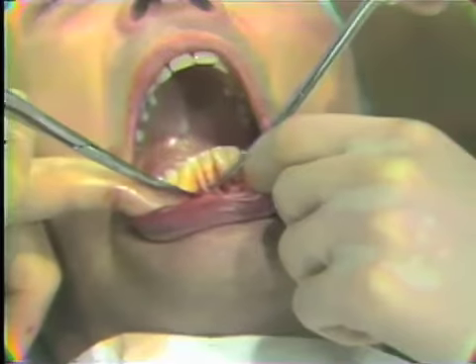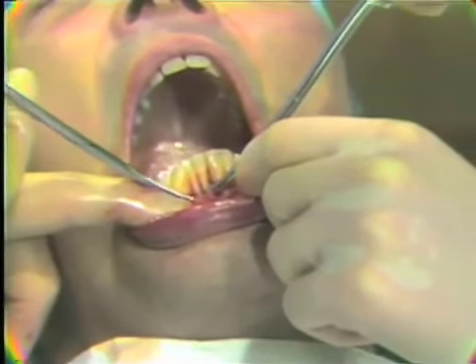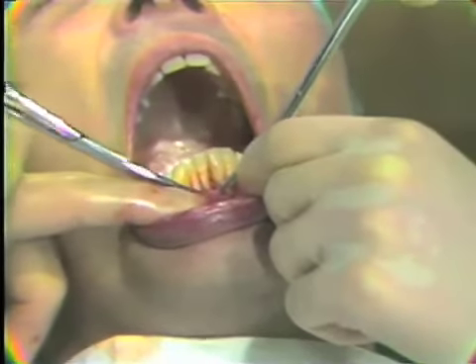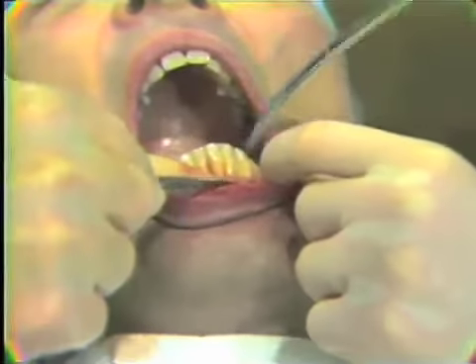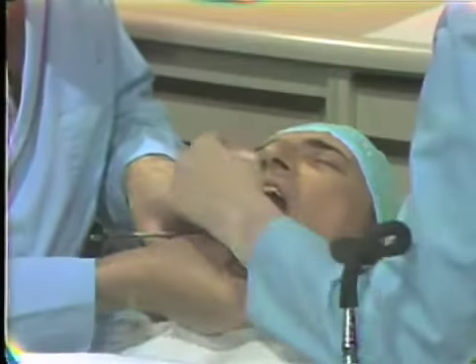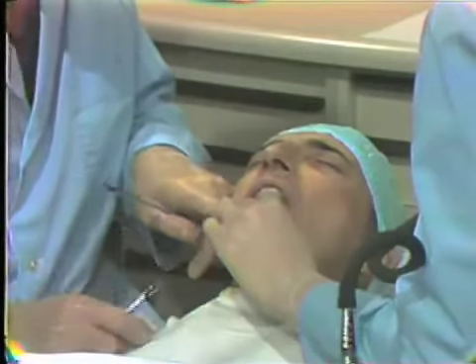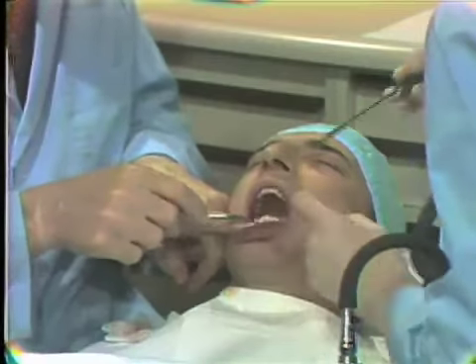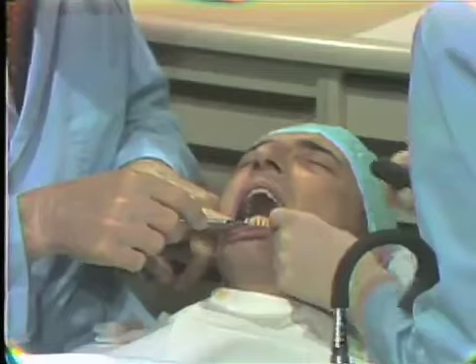There's one more right here, a bit of a tag here that, again, holding with the aspirator, being able to see the attachment, we can very nicely excise that so that the underside of the flap is smooth and will adapt nicely into the surgerized area for suturing. The use of a gauze sponge to press against the flap to note the adaptation of the flap, to again clean in the mucobuccal fold area, permits us to see the edges of the flap, the contour of the flap, just prior to suturing.